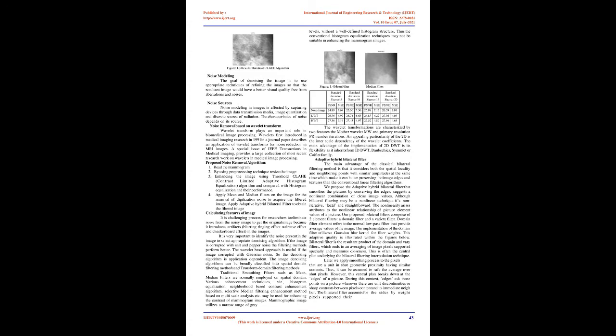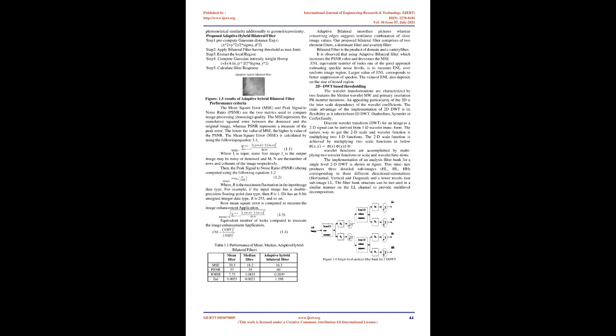Step 1. Threshold CLAHE technique is applied on original input mammogram to improve the contrast. Step 2. Hyper-analytical wavelet transform, HWT, is applied on the output obtained in the first step, then the segmentation at various scales, multi-resolution, to detect microcalcifications and other abnormalities. Step 3, the proposed nonlinear complex diffusion-based unsharp masking and crispening method is applied on the enhanced mammogram. Step 4, the proposed modified threshold CLAHE-based image segmentation is applied on mammograms obtained in Step 3.